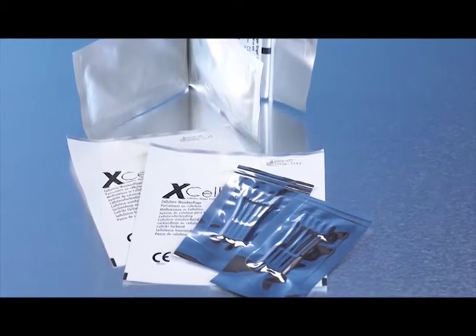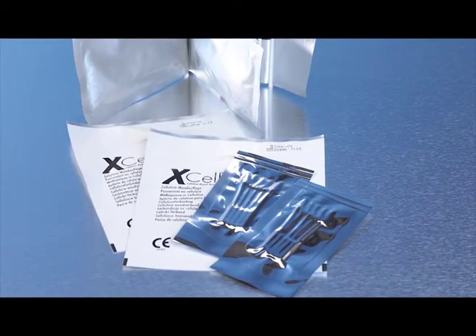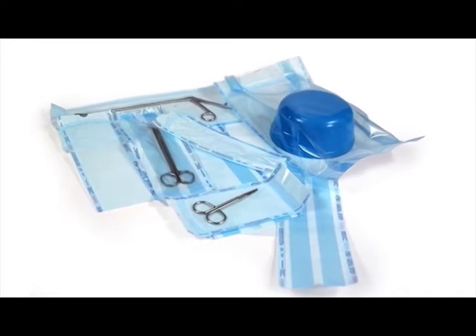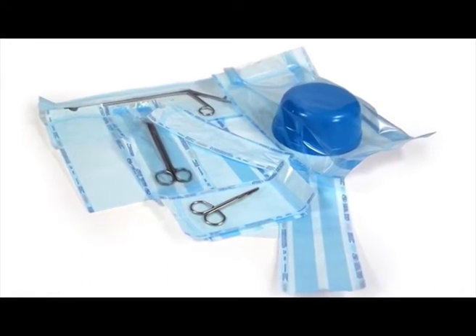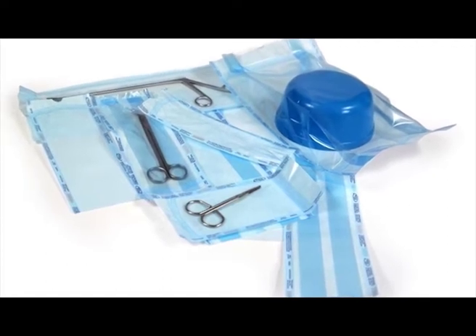The laminated film is stable enough to survive the sterilization process and gives good protection against recontamination. Although laminated films are always used for hospital pouches, dentists using dry heat sterilization can use pouches made only of nylon film. Next is paper.